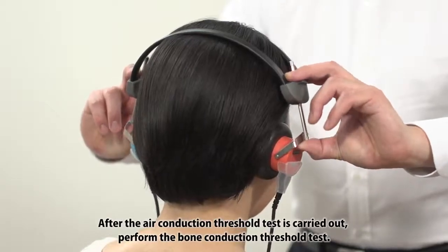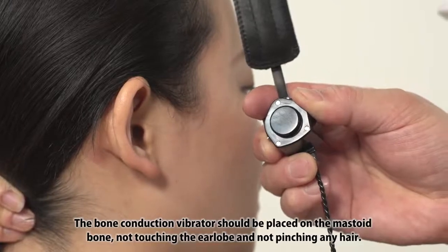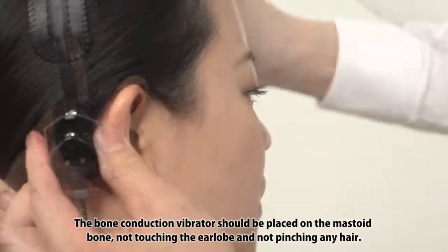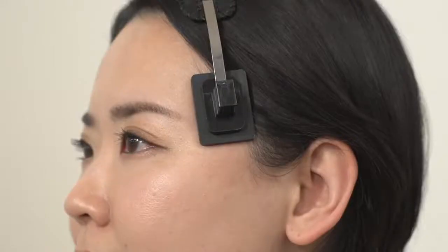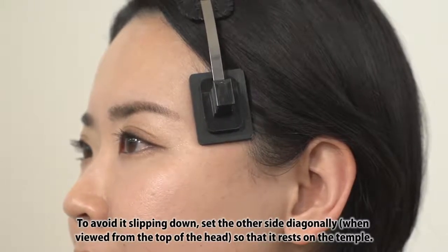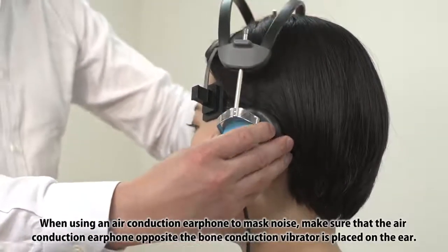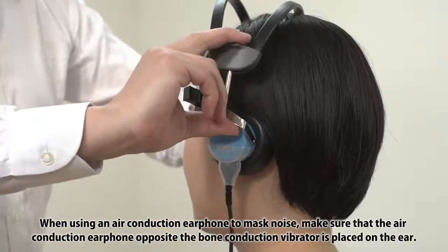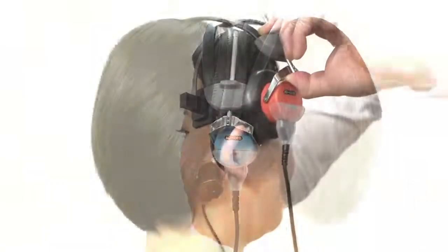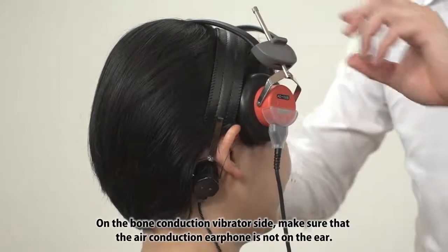After the air conduction threshold test is carried out, perform the bone conduction threshold test. The bone conduction vibrator should be placed on the mastoid bone, not touching the earlobe and not pinching any hair. To avoid it slipping down, set the other side diagonally, when viewed from the top of the head, so that it rests on the temple. When using an air conduction earphone to mask noise, make sure that the air conduction earphone opposite the bone conduction vibrator is placed on the ear. On the bone conduction vibrator side, make sure that the air conduction earphone is not on the ear.